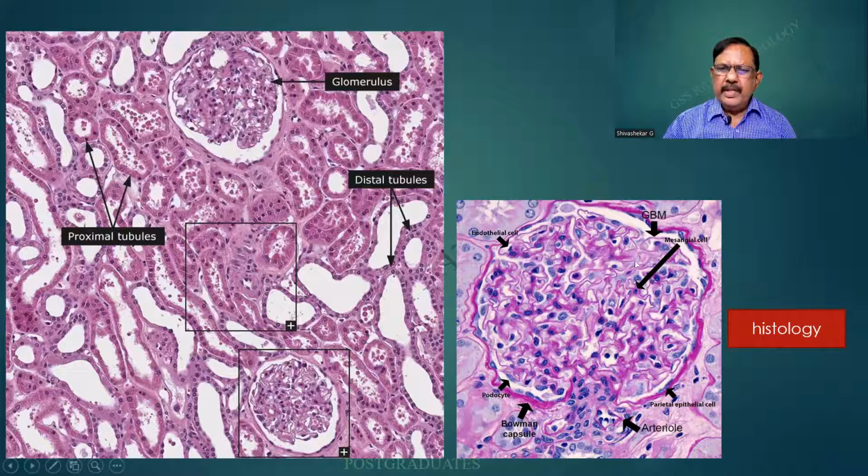And the pink substance that I'm finding in between will be the mesangium or the mesangial matrix. This is the urinary space over here. And here also I am observing some blue structures, which are the parietal epithelial cells. So kindly be aware of it. So you have got an arteriole over here and a venule. This kind of concept you people should have.